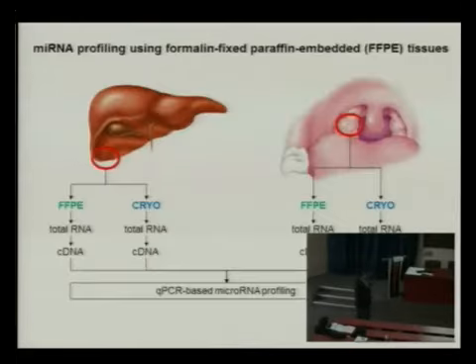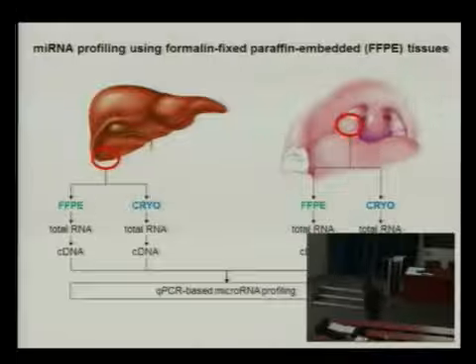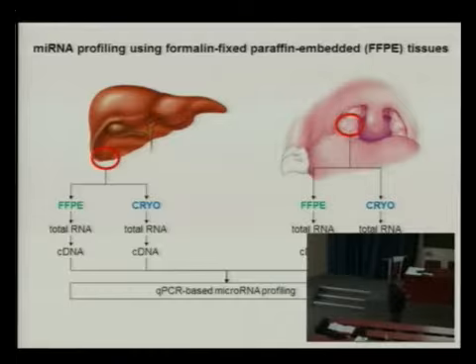And we performed one sort of dedicated approach. We took 4 samples of liver tissue and 11 tissues from the tonsil, and each time we divided that and formalin fixed half of the sample and the other half was cryoconserved, and the same was done for the tonsil samples.